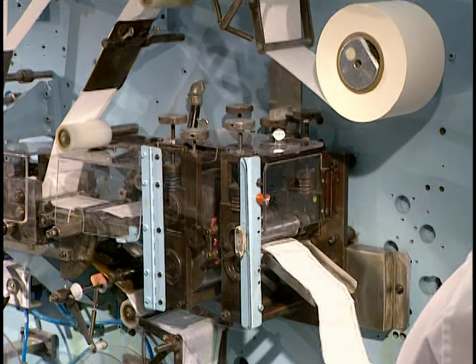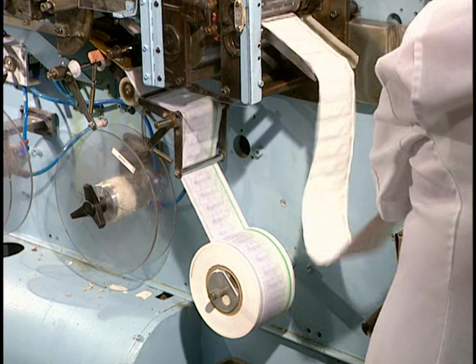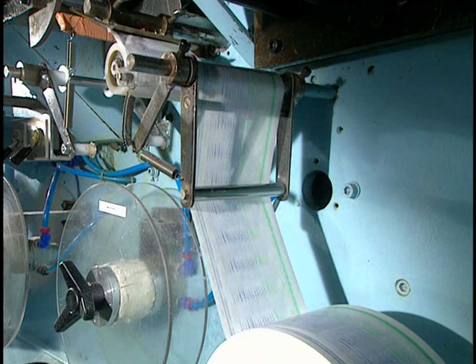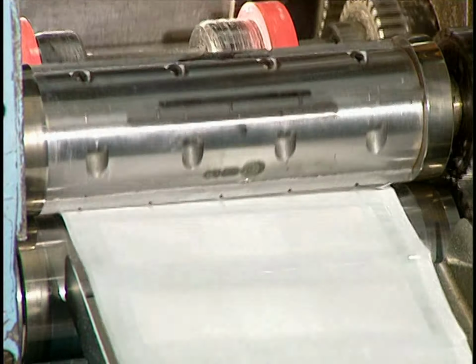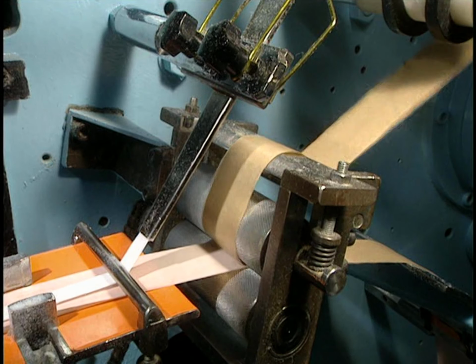This machine applies the unprinted white wrapping paper that protects the bandages. And now they proceed to packaging. Packaging speed depends on the product, varying between 300 and 1,500 bandages a minute. This roller perforates holes that allow the bandages to be easily separated from one another. Strips of bandages are placed into boxes.